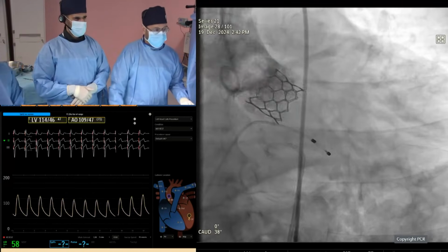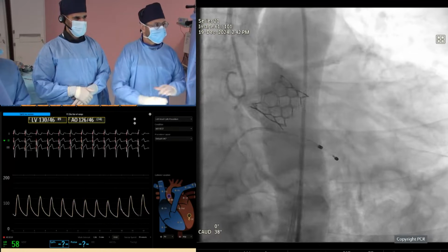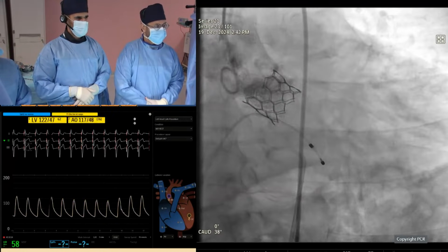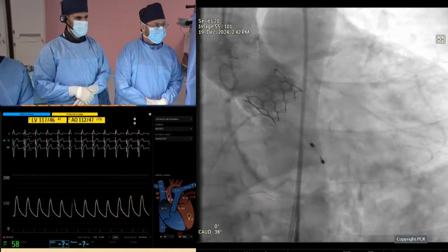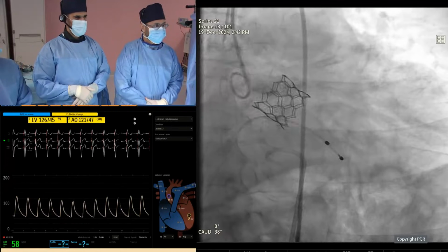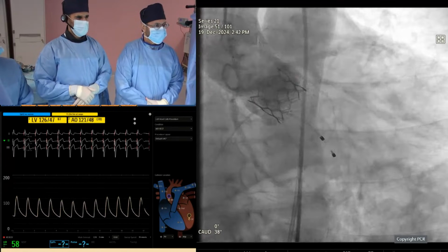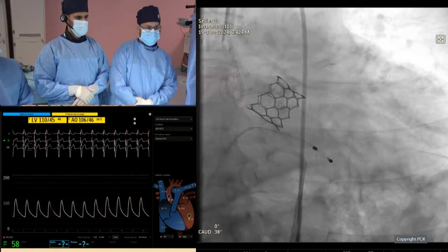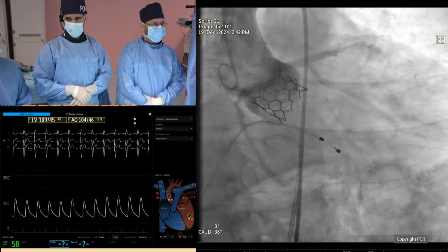And you did a good job. Look at the shallow implant that you have. I just congratulate you on that. What the CHB was, it seems that it was inevitable because you couldn't have done it to a better perfection than what you've done. Anything less than that would have had other aspects of.